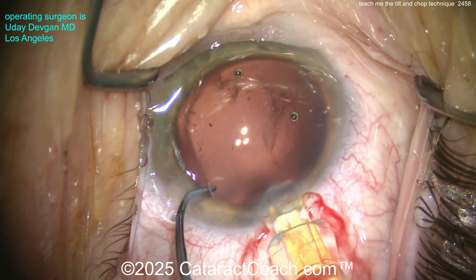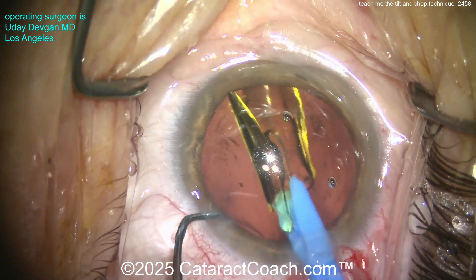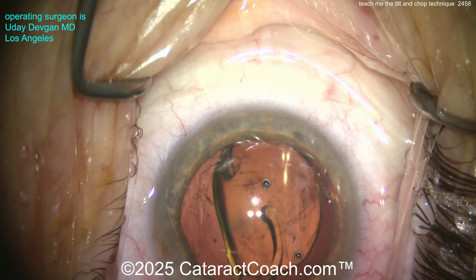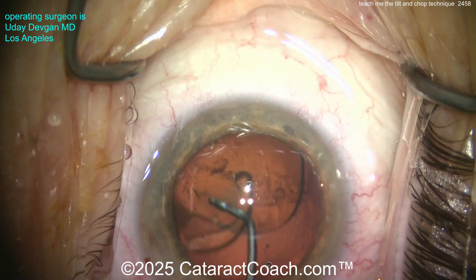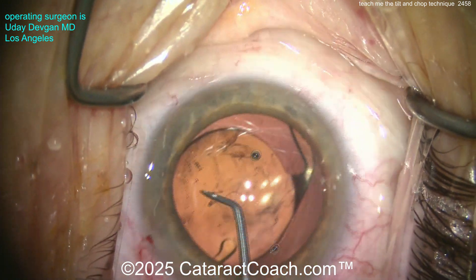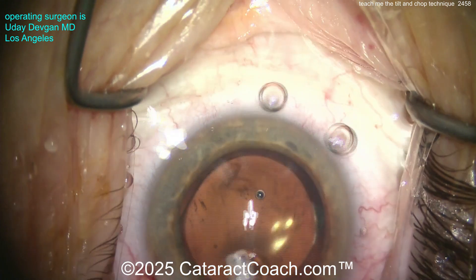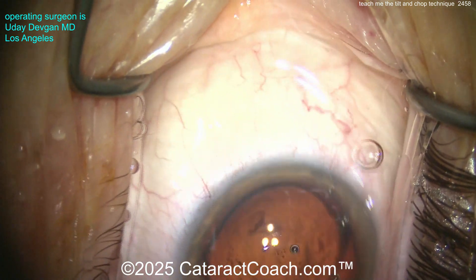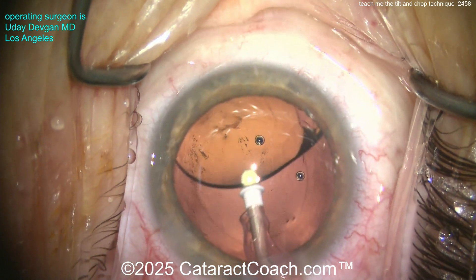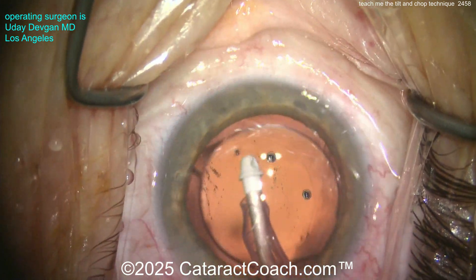Here comes our preloaded lens, getting that delivered right into the eye. It has a nice trigger on this delivery system. Using the chopper to fixate the eye with the side port — and now there's the lens in the capsular bag. Let's dial it in. The optic is six millimeters in diameter — let's see if we have complete overlap with the rhexis. Indeed we do. Looking good.